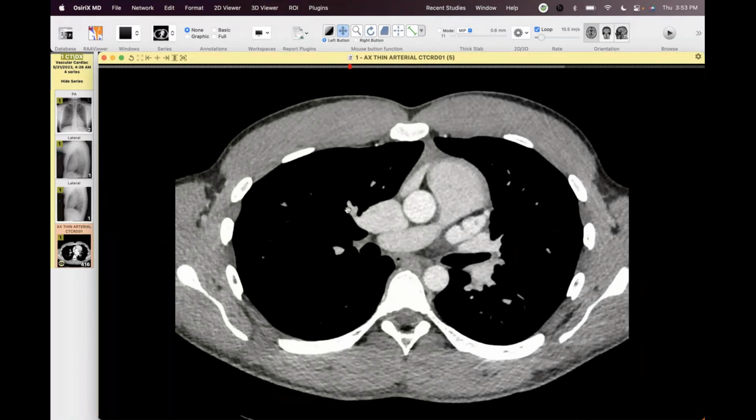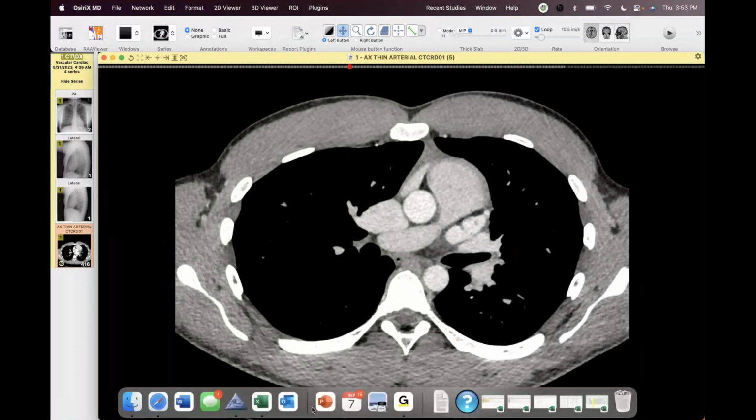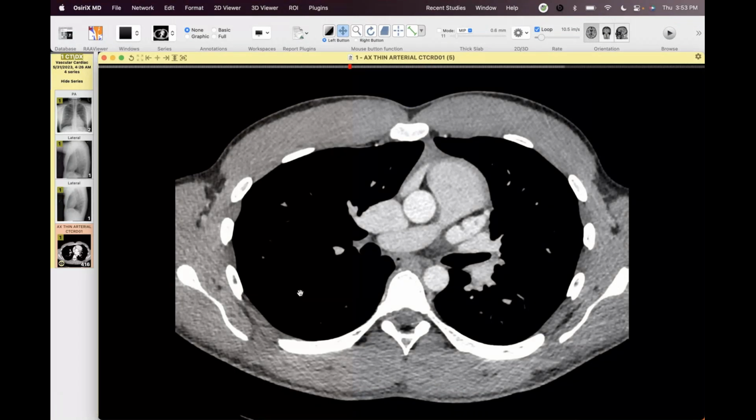So, okay, I will stop with that. It's funny you mentioned that. We just had a case today, a trauma, a two view, and on the frontal view both arms were down, and there was a subtle abnormality in the humerus, but on the lateral, only one arm was up, and because the affected arm was down, you could see the fracture clear as day.